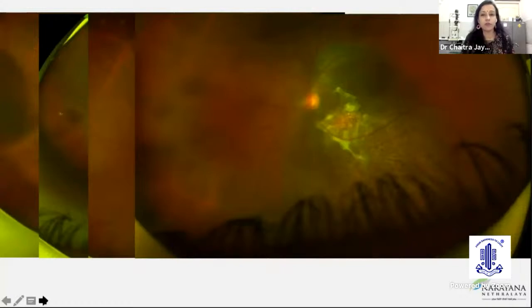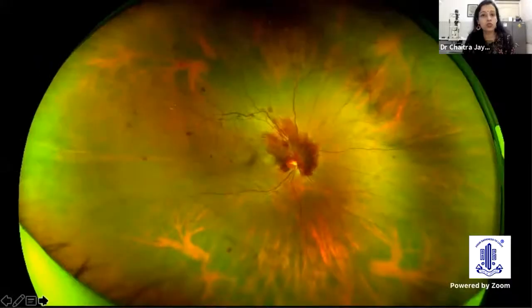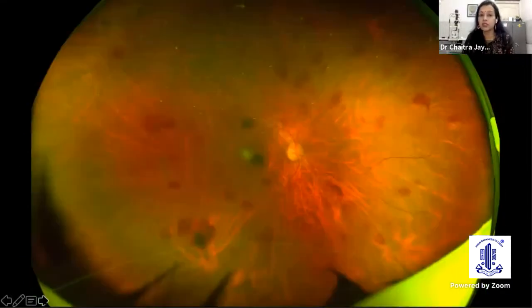This was a patient who actually, unfortunately, my animation is not working, had a massive bleed in the posterior pole. This is on final follow-up today when I saw her, good resolution of her submacular hemorrhage. Blood dyscrasias: we see a lot of systemic issues, which we pick up actually in the retina department on the first go. Again, the severity and extent can be determined. This is a patient whom we saw first in our center, eventually investigated and found to have ITP, now on systemic management.